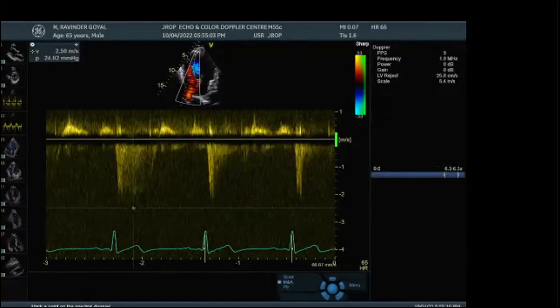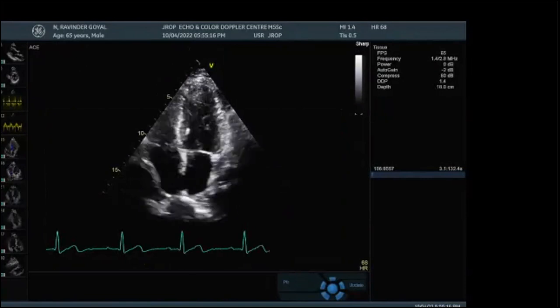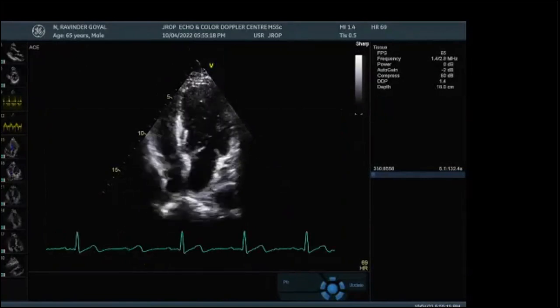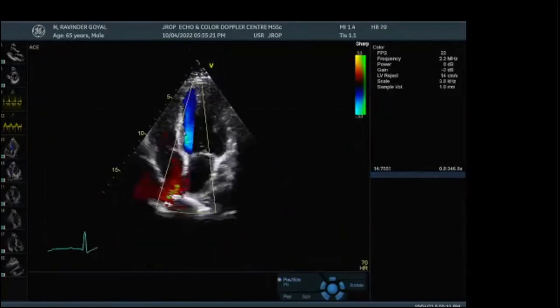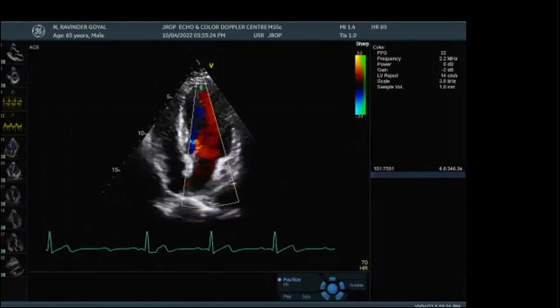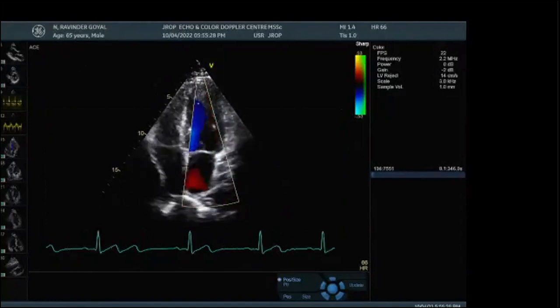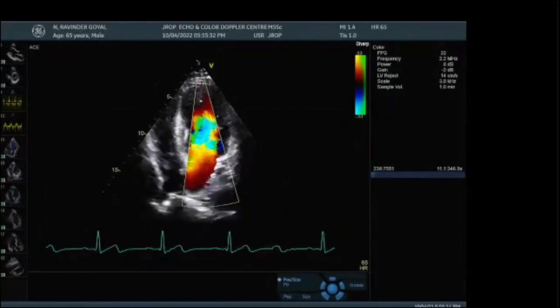And sir, what about the M mode? Did you discuss M mode slides in this? We did not talk about normal M mode right now. We'll come back to M mode the day after, next to next week. But we can show you color M mode.